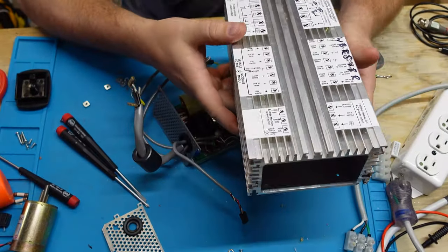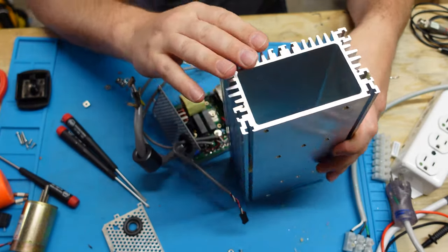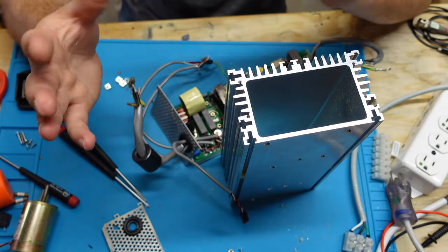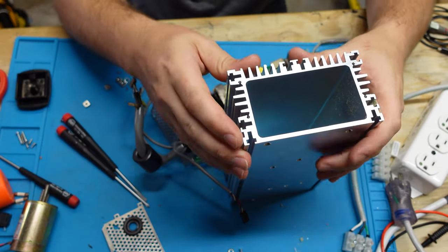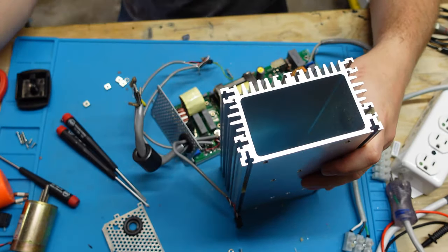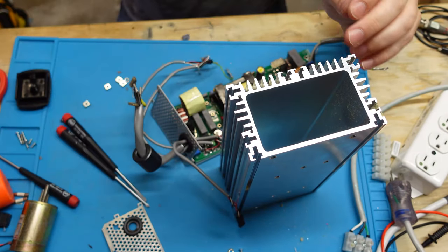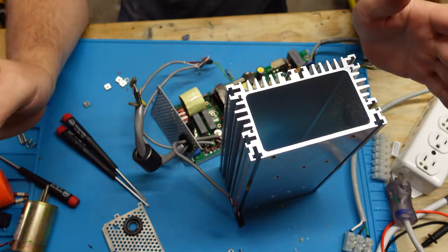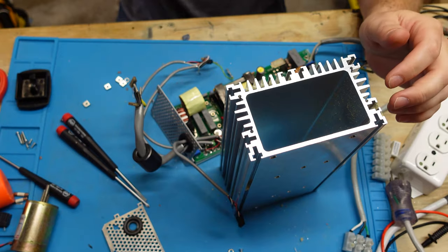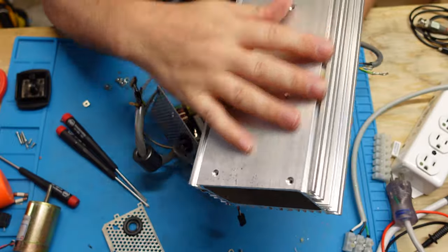Well, that's what I thought, guys. It's a solid extrusion. And if you guys don't know, an extrusion is basically when they take molten aluminum, or it's molten because of the immense amount of pressure that they put in there, and it's squeezed through a die, and the die is in various shapes. So this is an extrusion. This guy here is an extrusion. There's all sorts of stuff that we use throughout our day that's extrusion. I mean, even this tripod, these right here are probably extrusions, the legs. So anyway, that was one solid extrusion. I can't believe that.